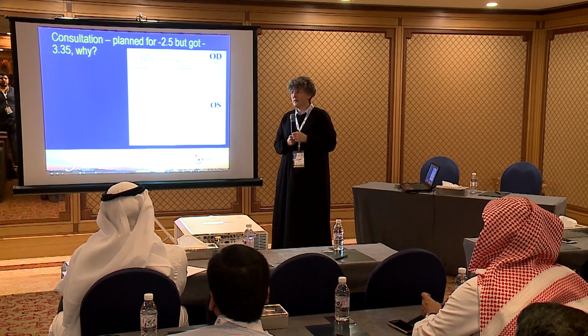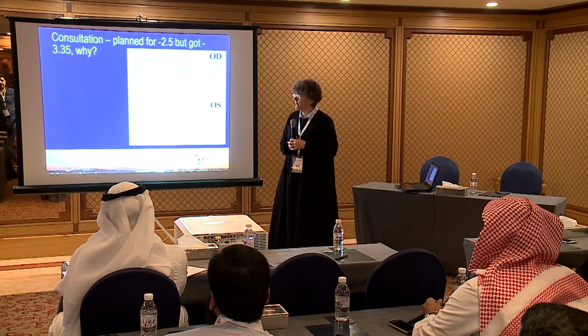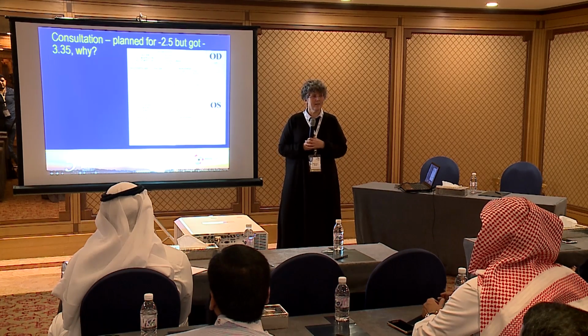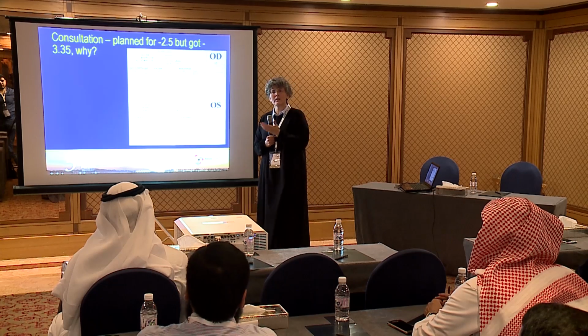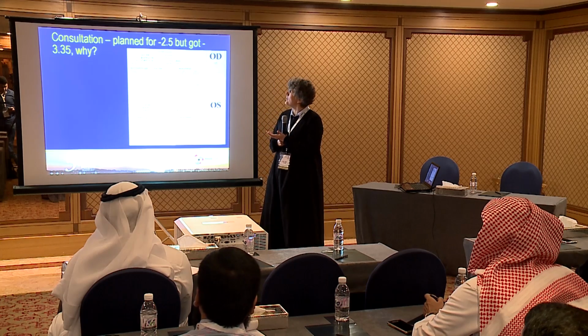Was he post-LASIK, this guy? No, not post-LASIK. No, a pristine eye. He just came with the cataract. No previous surgeries. There's something missing on the scan. The ACD. They were using a very old formula. They didn't have the ACD, so they were using an old formula on an abnormal eye.